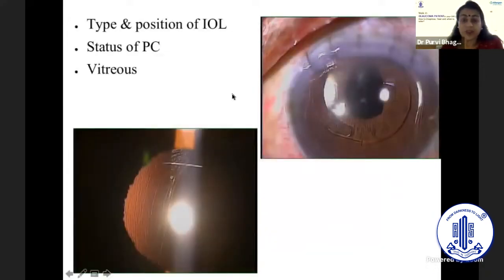In cases of pseudophakic and aphakic glaucoma, it is also very important to see whether there is vitreous in the anterior chamber, and what the position of the IOL is. It will help guide your site of filtration surgery so that you can avoid the sites where vitreous is there, or where synechia is there, or where the haptic is lying. And if there is frank vitreous, you might even look for macular edema. In these cases, you would want to avoid any kind of PG analog.